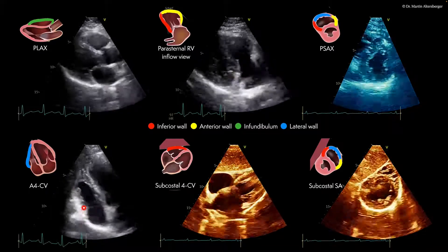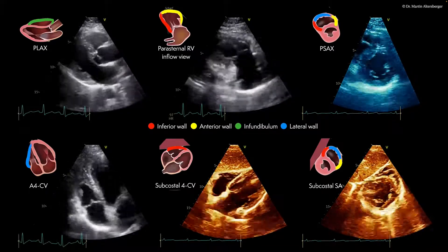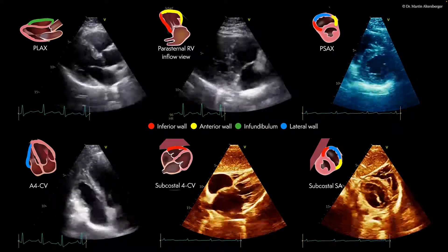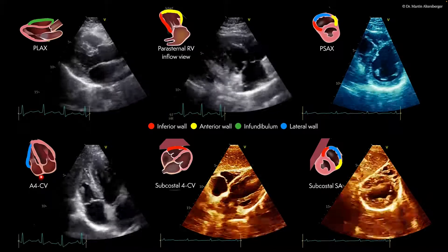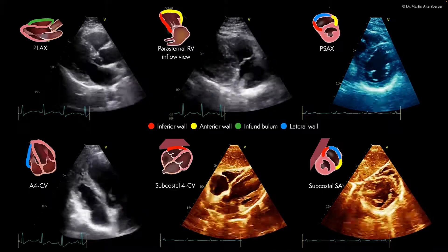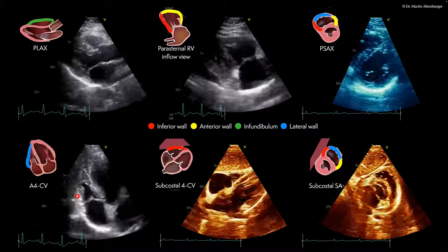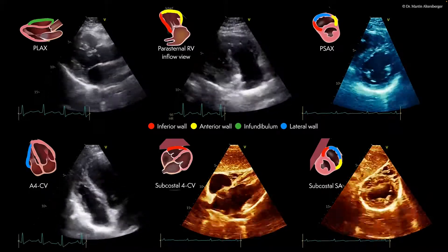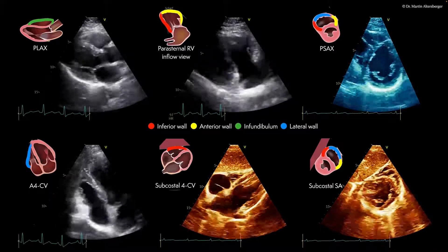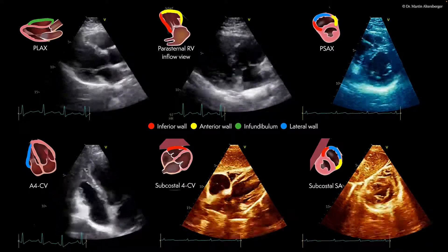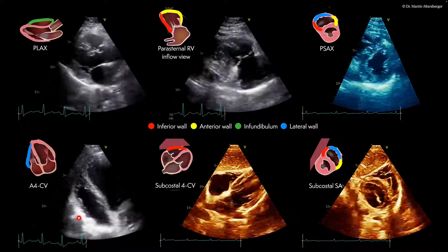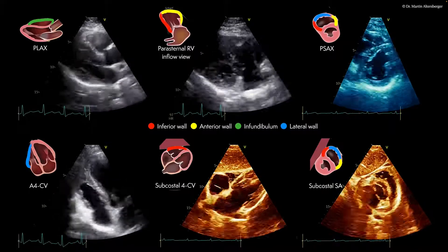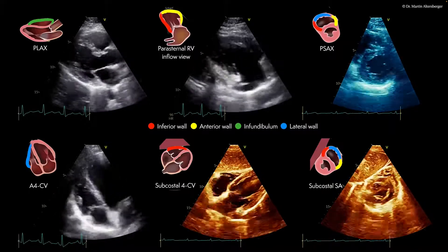In a focused four-chamber view, where you visualize the right ventricle, we have the free lateral wall, which we are also scanning and interpreting in, for example, strain echocardiography with the free wall strain, or where we measure the TAPSE and the S' in this region, so the lateral tricuspid annulus.